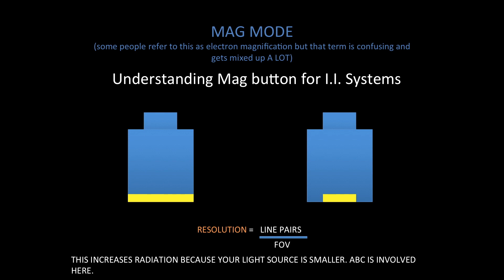I think this is a very short summary that explains an important concept of magnification mode for image intensifier tubes.